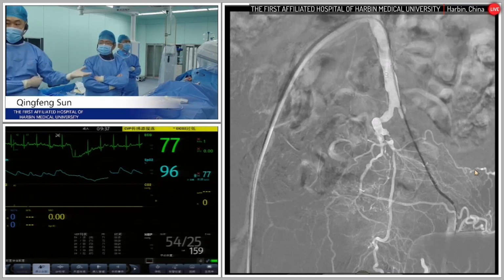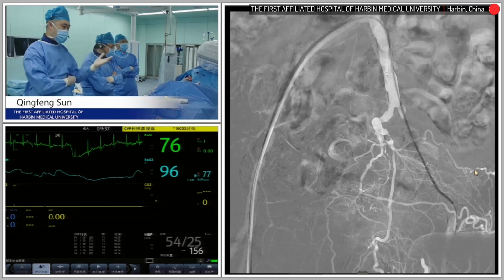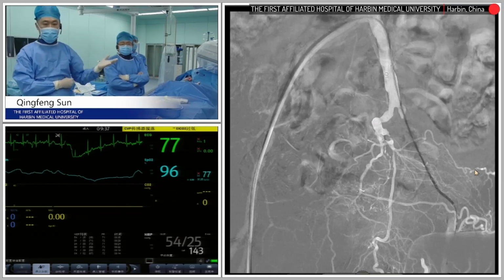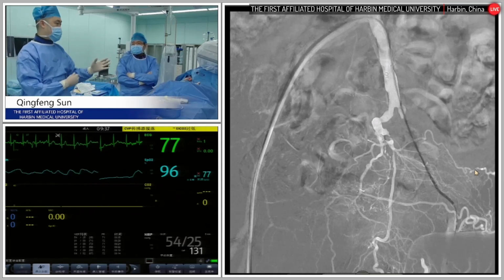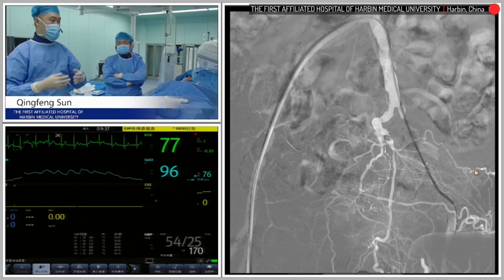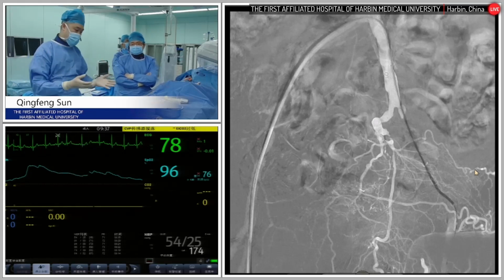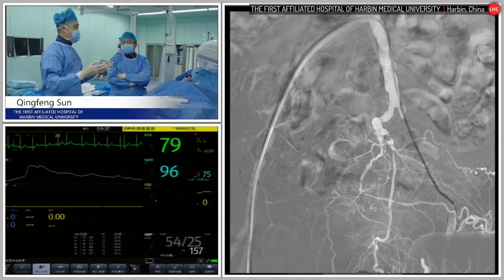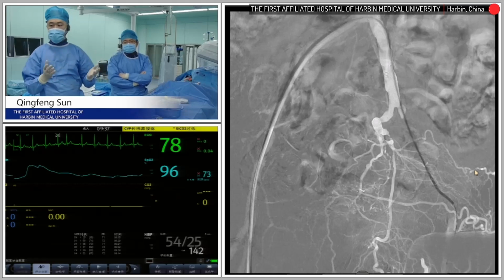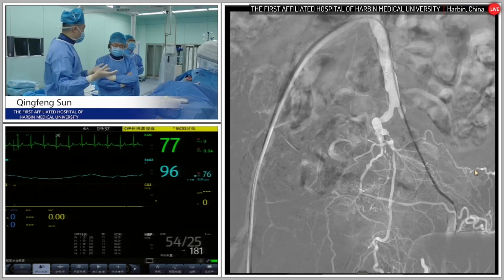This is our daily work, people. We are doing this every day. We are not using fancy technology, fancy instruments, or IVUS every day, because, like I said before, different patients in different countries have different conditions. I think Western world doctors don't have to evaluate the expense too much.